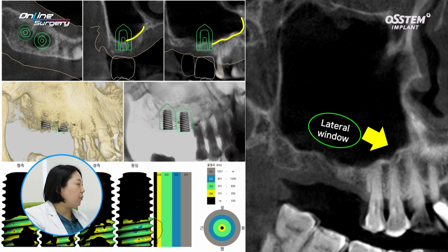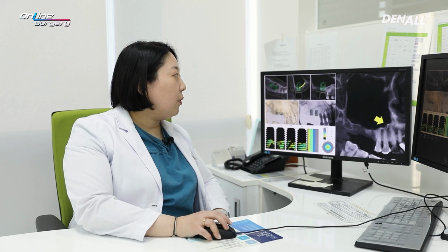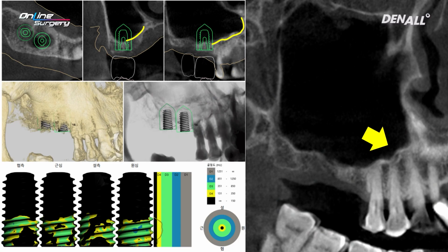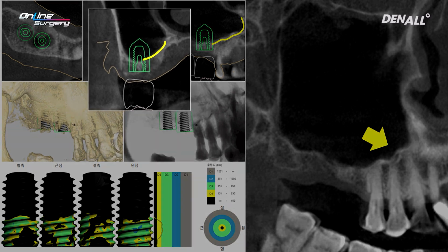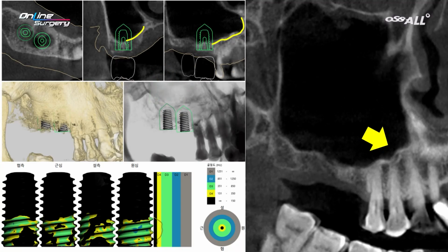Here, an oval-shaped lateral window is created. During sinus lifting, bone goes to the distal side without a problem. Often, bone is not easily put to the front side, so sinus membrane should be properly detached and lifted. So slightly you need to pack the bone mesially. A buccal window was created and the bone may not go to the palatal side sufficiently, so the membrane should be lifted to the palatal side for bone grafting.